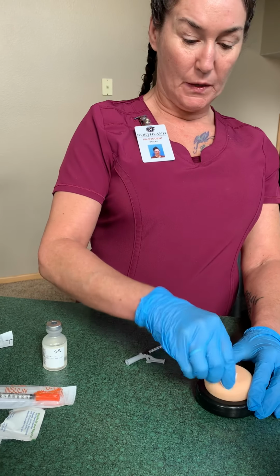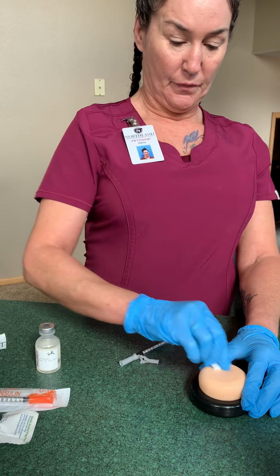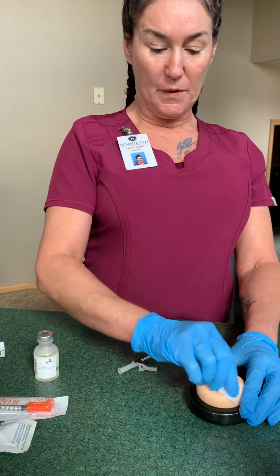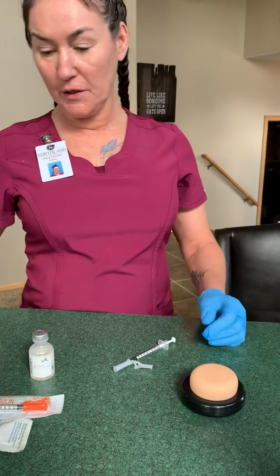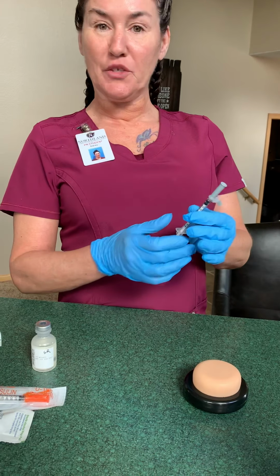While I'm preparing the skin, I would have already asked my patient their name and date of birth, made sure they were comfortable with the test they were about to receive, and if they had any questions for me. And then we'd administer the shot.